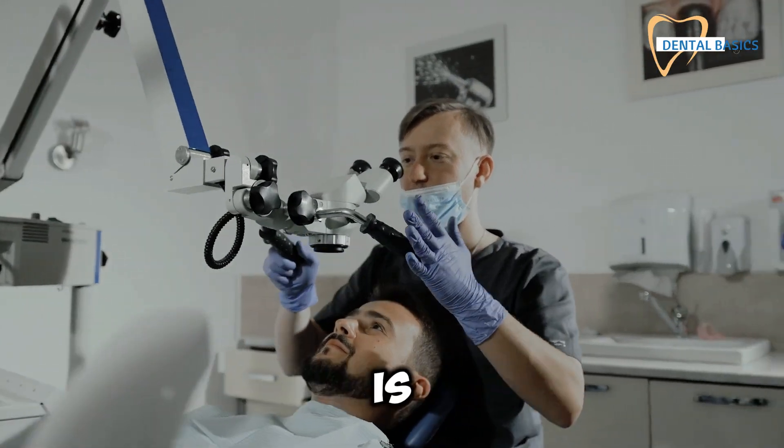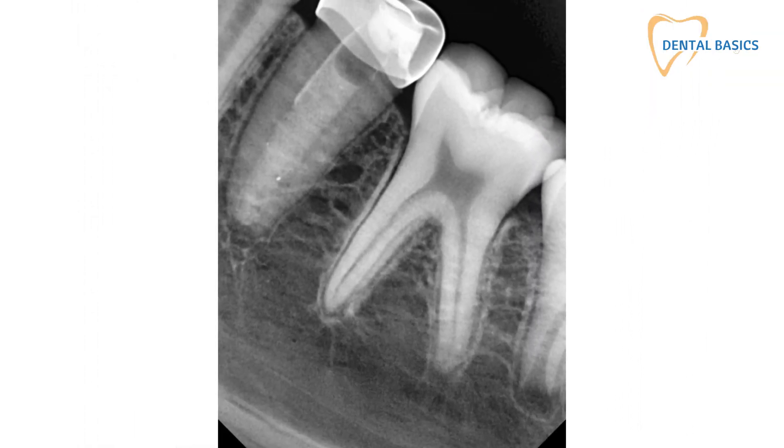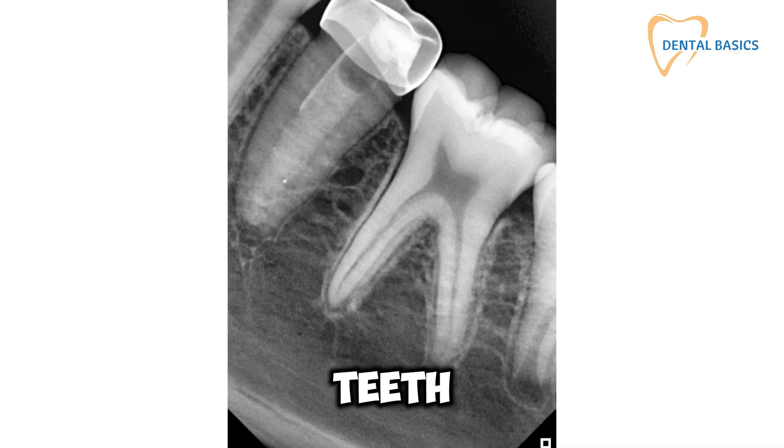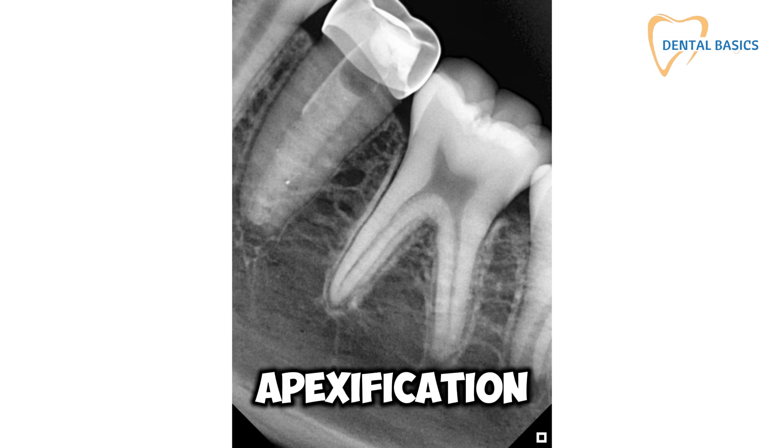Apexification is more than just a procedure — it's a vital tool for every dentist's toolkit. Perfecting these steps can save teeth and enhance patient satisfaction. Ready to become an apexification pro?